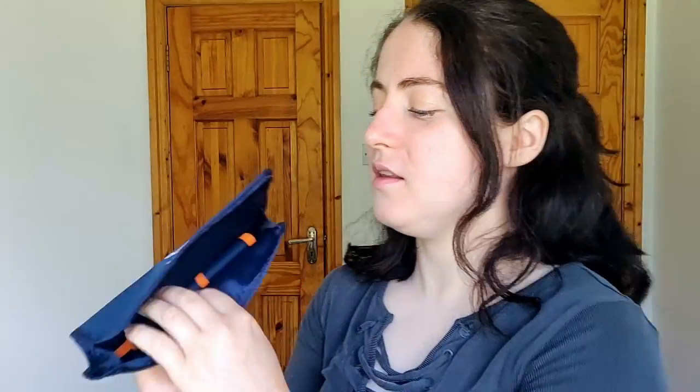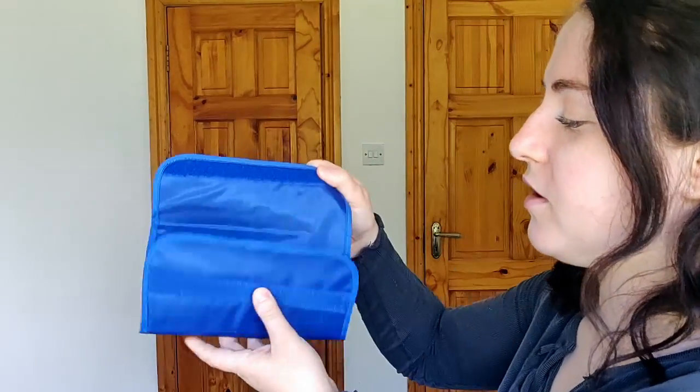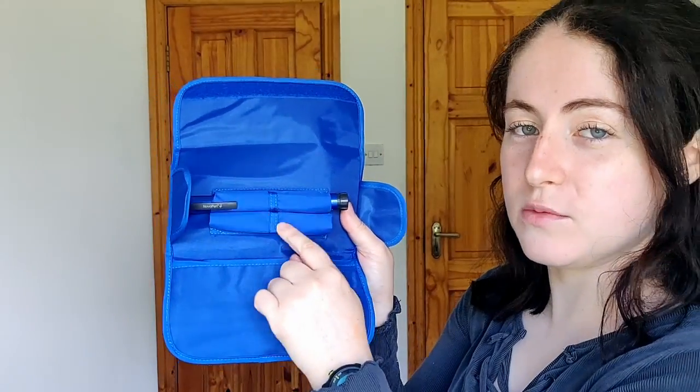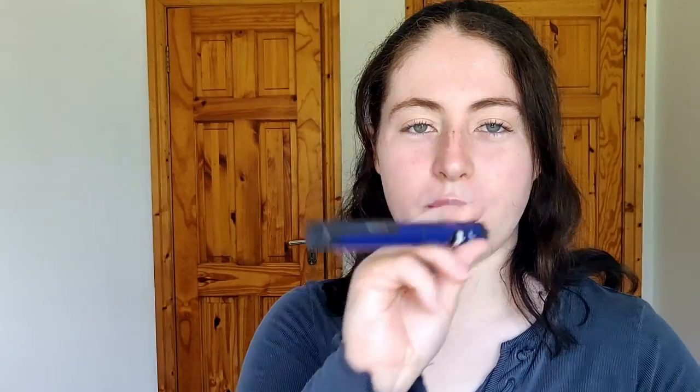And then finally the Novo pen 4 came out in 2005. So between three and four, there's a big gap where there wasn't another main Novo pen. I have one here today to show you. We have a Velcro pouch — now obviously it's much bigger, and unlike the 3 Demi which is just loose inside, the Novo pen 4 has a holder in the pouch so you could actually put the pen in and put in your background insulin as well.